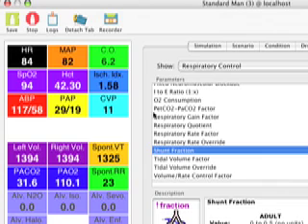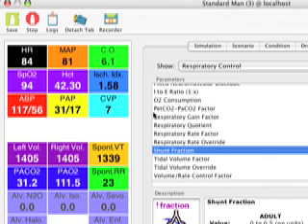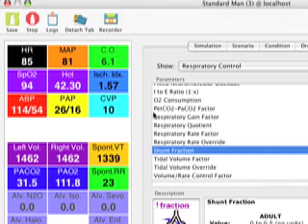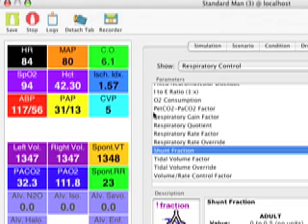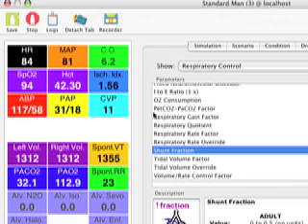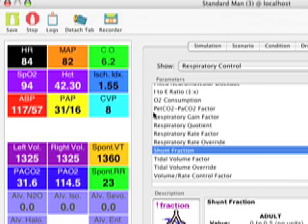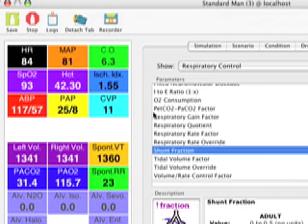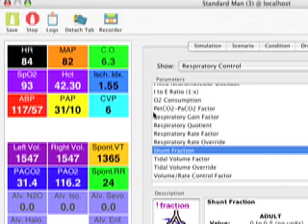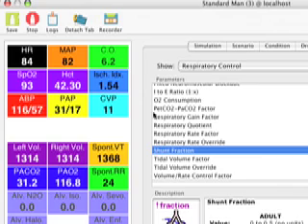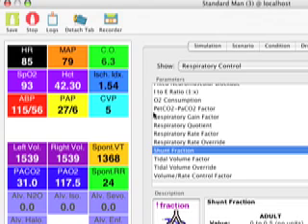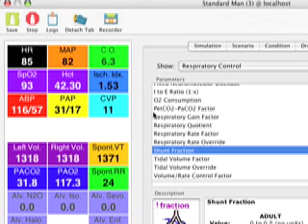If it's the Human Patient Simulator with the more sophisticated software and sensors, and if someone puts oxygen on him, he will actually improve his sat in a physiological fashion. So there's sensors in the mannequin that will do that. If it's the ECS model, then what will happen is if a student applies some oxygen, whoever's operating will have to try and figure out if it's the right appliance and then make adjustments appropriately.